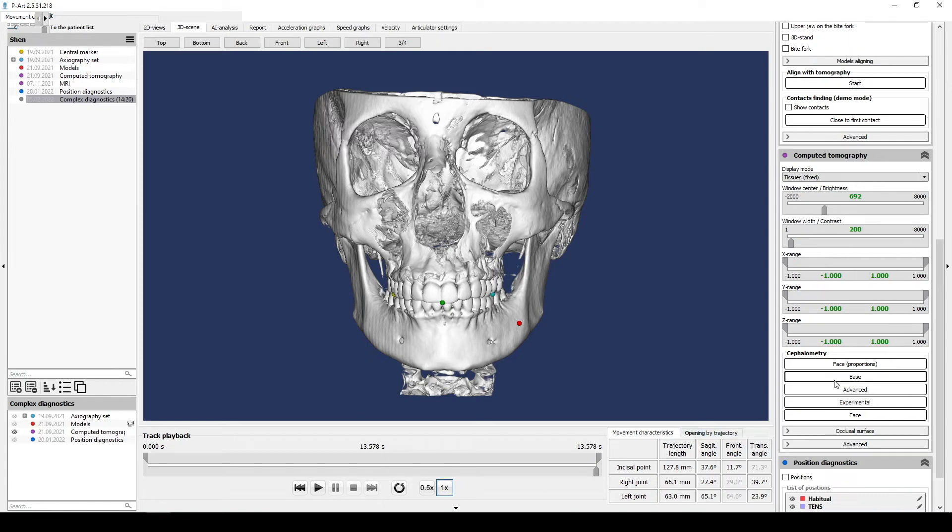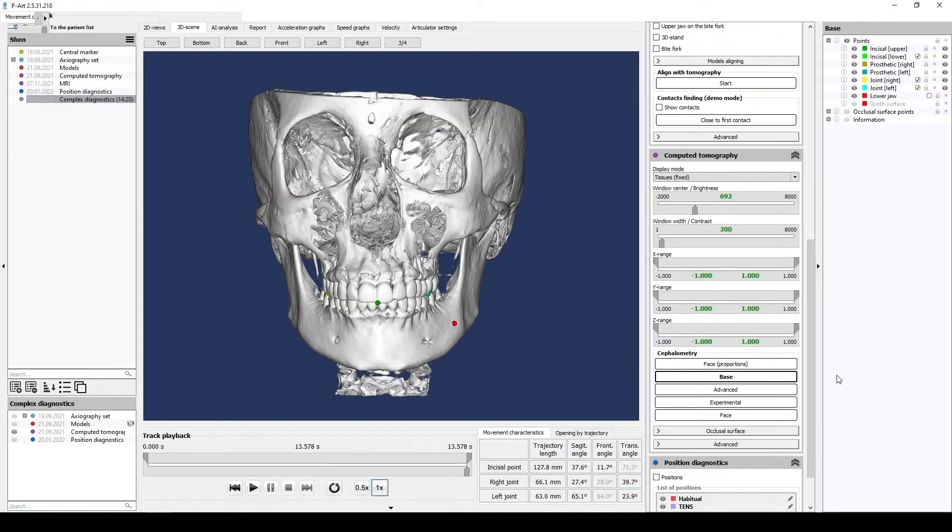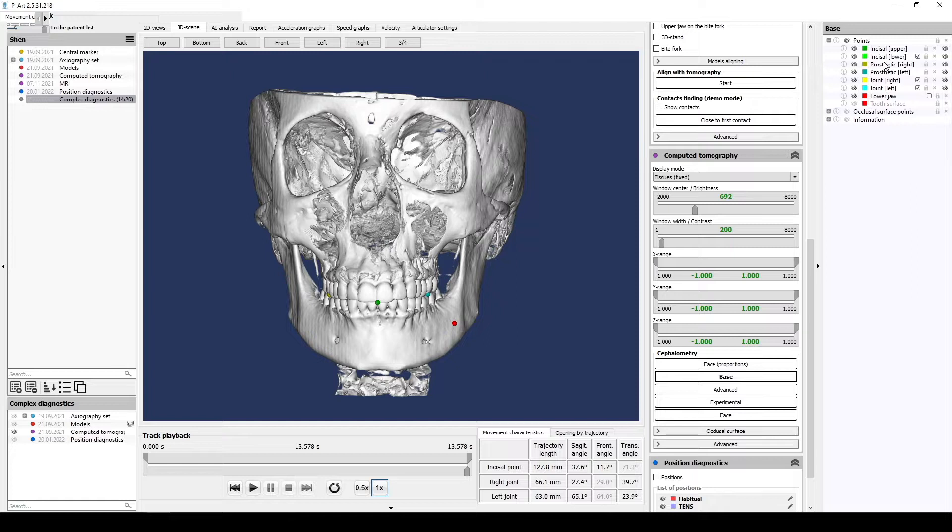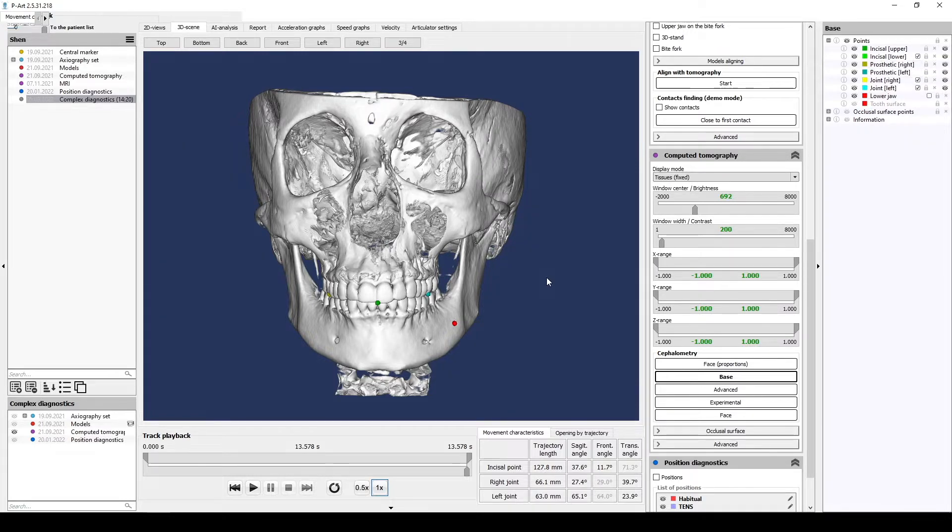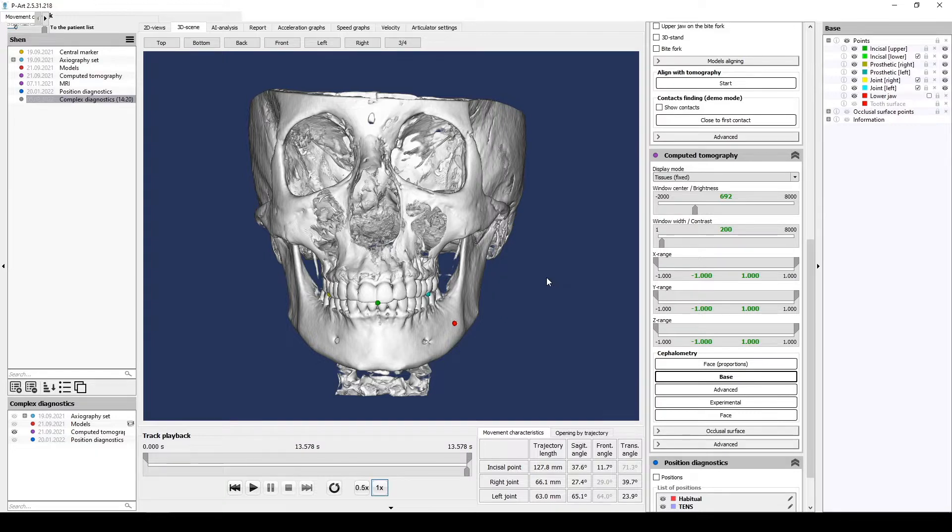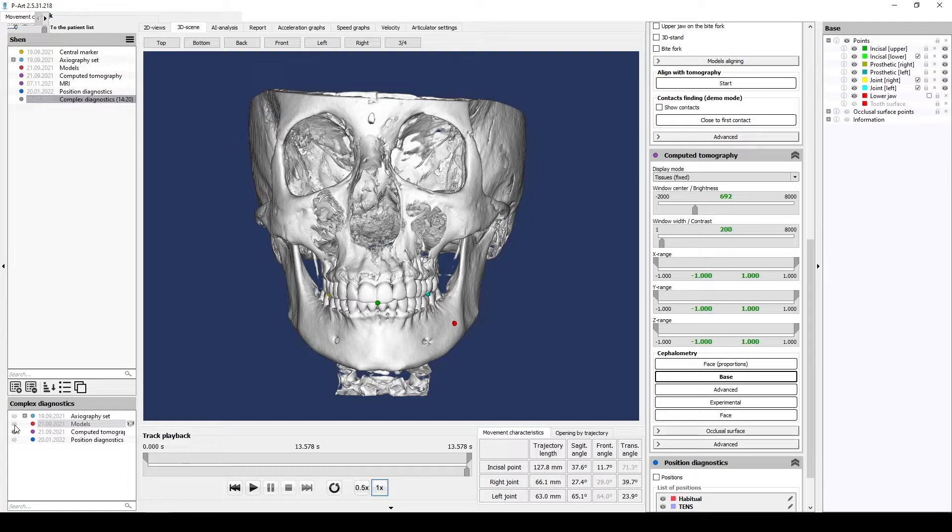Combining CT and models. After we finished base CEPH in the tomography section, we have prosthetic points: upper incisal point, right molar point, and left molar point. According to these points, we will superimpose individual models and CT.